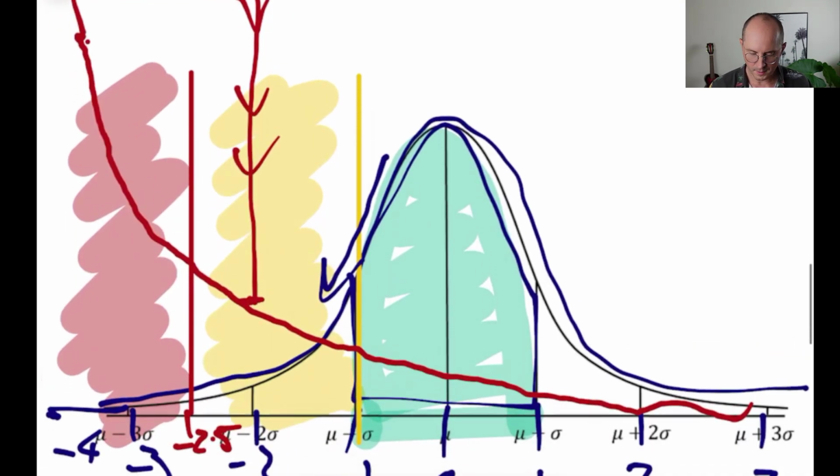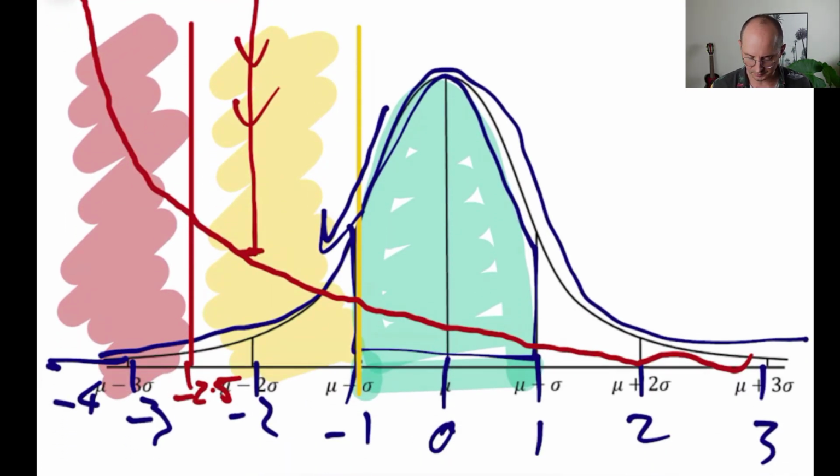Now, whereas when you go from a -2, which would be kind of along here, to a 0, the drop in relative risk of a fracture is much smaller. Now, I'm not saying this to belittle the improvement with T-scores at this level. In fact, men at this stage still need to strengthen their bones to give yourself as much buffer as possible in case things start to deteriorate. So you have a longer runway before things get potentially dangerous.